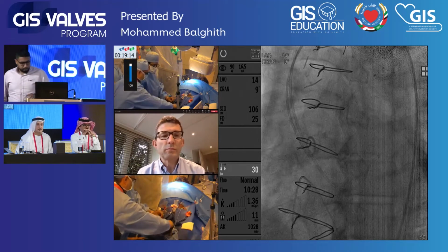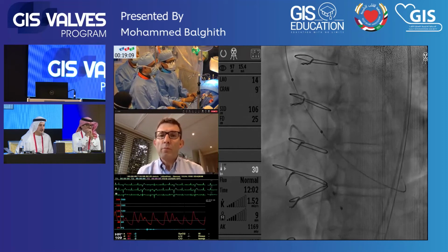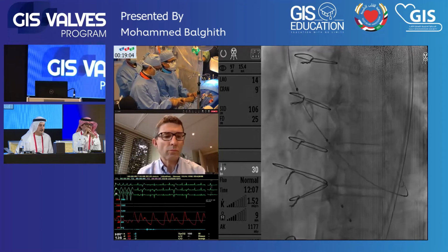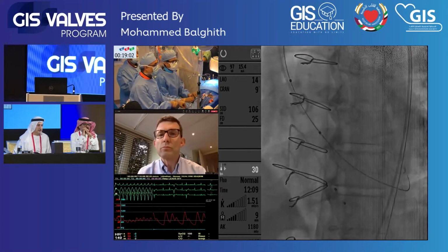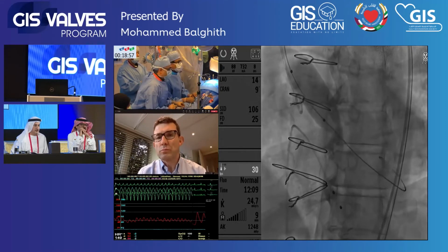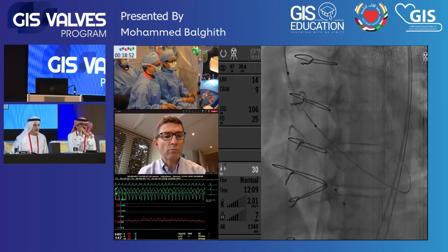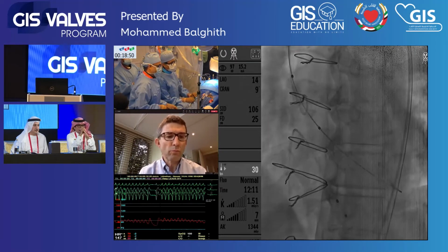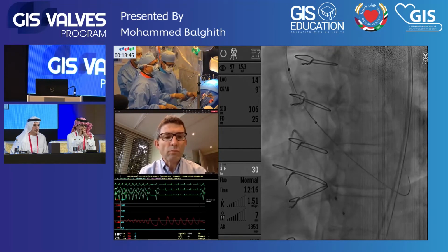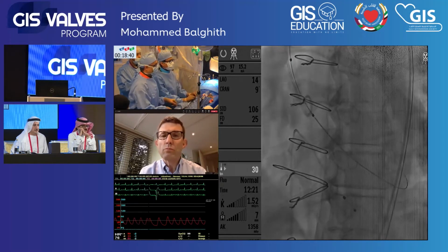But inshallah you're wrong. You can start pacing 120? 140. 140, okay, fine. Go ahead. Very good. Deflate, it's okay. Off pacing? Okay, that's fine. The port was open for the contrast, that's why it's there.